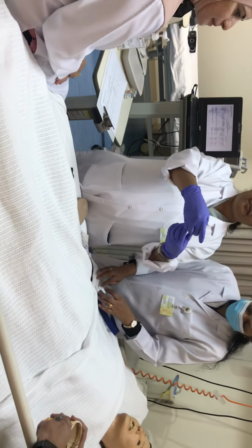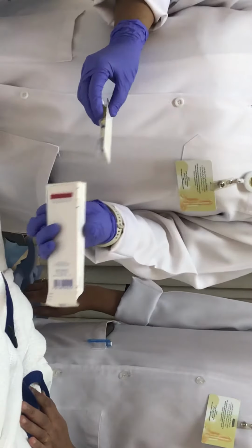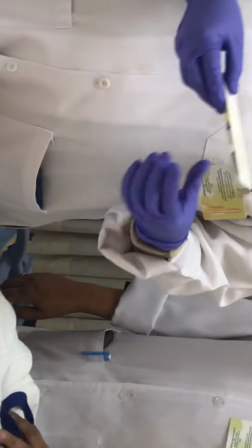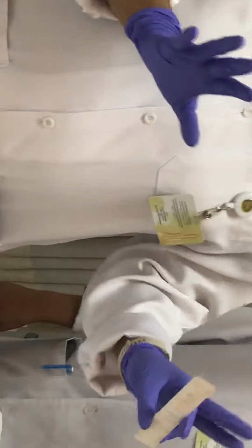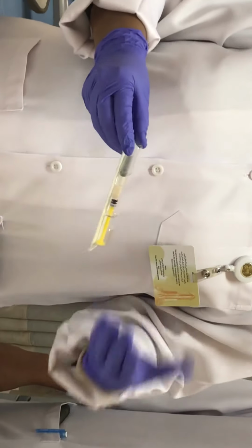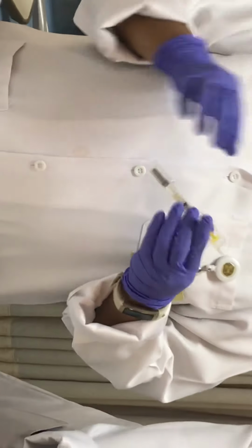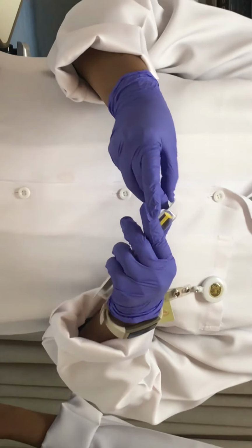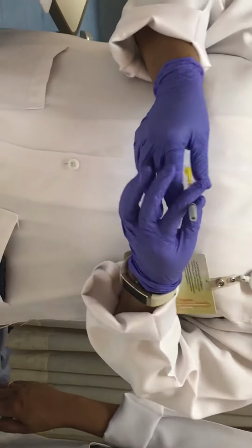Okay, so this is the pre-filled syringe. Heparin is always a pre-filled syringe, and you will find that 4000 units is 0.4 ml. Like that, you will find 0.8 ml also. So they don't need to do any fixing. Just clean it, always given in the abdomen. They say in the abdomen it is better absorbed. That is the reason the companies give. Okay, shall I show one? Because this technique is different. But please do not mix it with the other technique, the insulin technique.